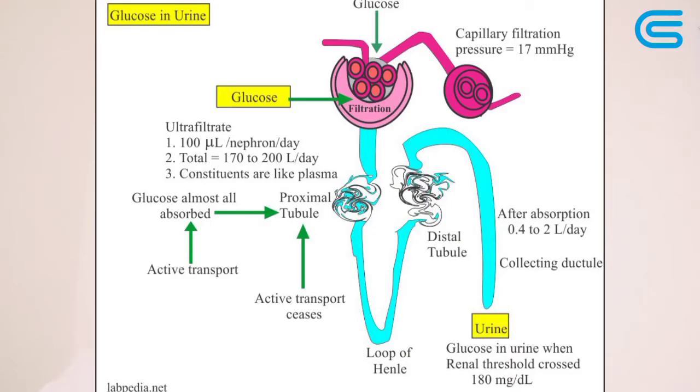So once we detect that there may be reducing sugars in this urine sample, that is when we will do more complex tests to determine the exact type of reducing sugar present in the urine. So I'll speak of something on glucose. The reason why we test glucose in urine is for unsuspected diabetes mellitus, or when we want to follow up an already known diabetic patient. All of the glucose filtered by the glomeruli is reabsorbed by the proximal renal tubules, and it is returned back into circulation.